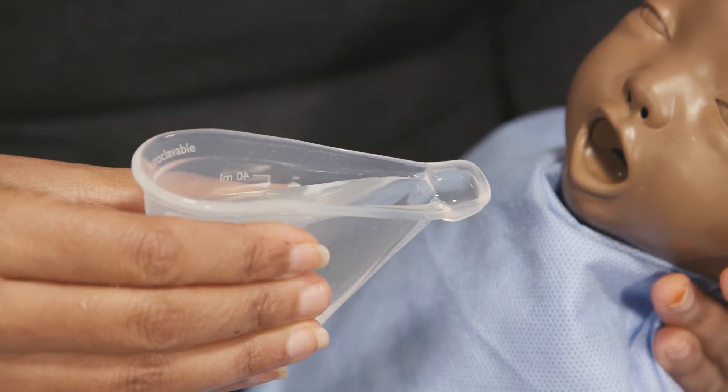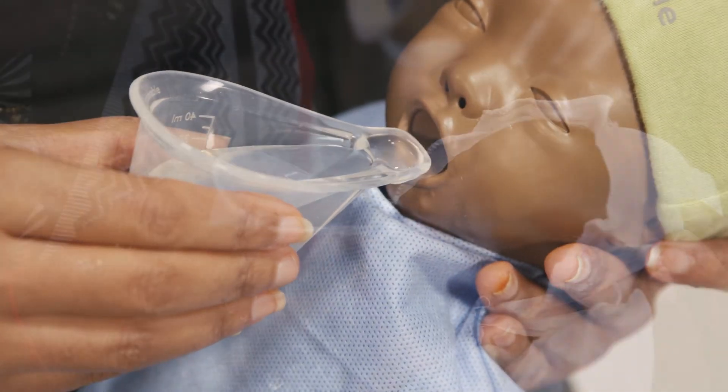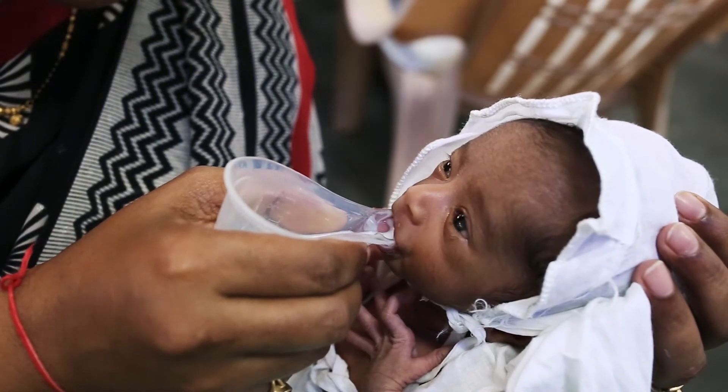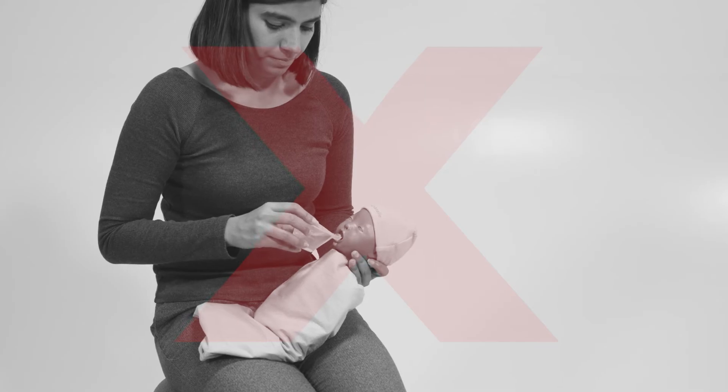Fill the feeding reservoir by gently squeezing the cup. Allow the baby to actively feed from the reservoir at the baby's own pace. Do not pour, as this may cause discomfort and potential choking.